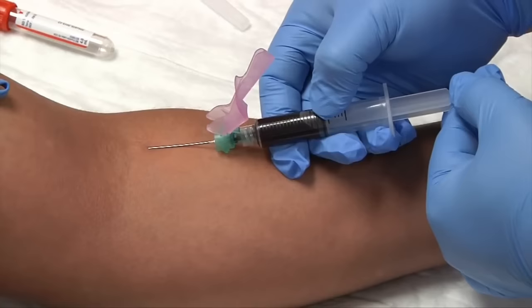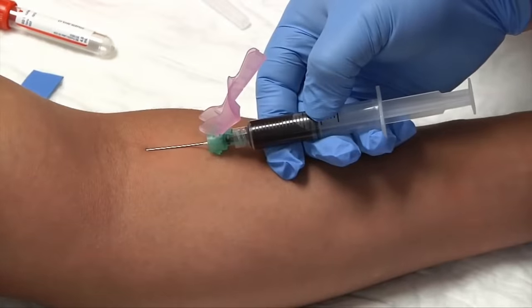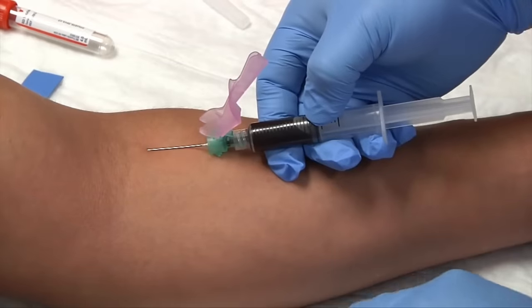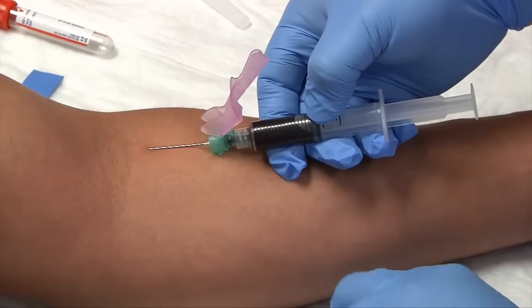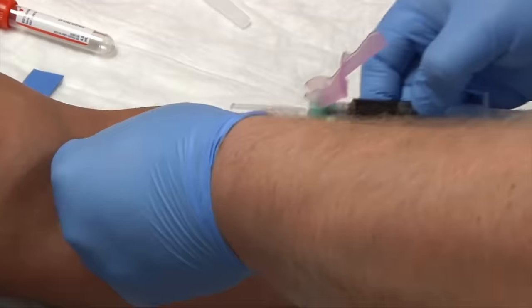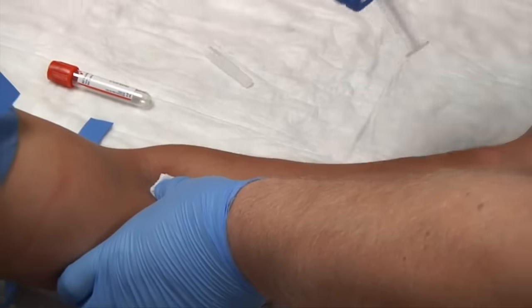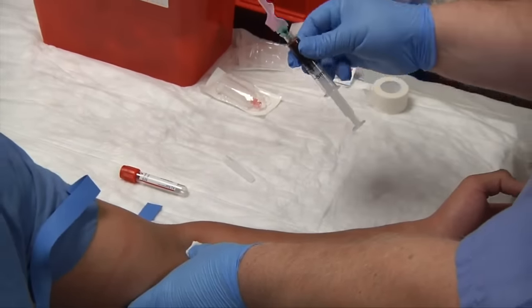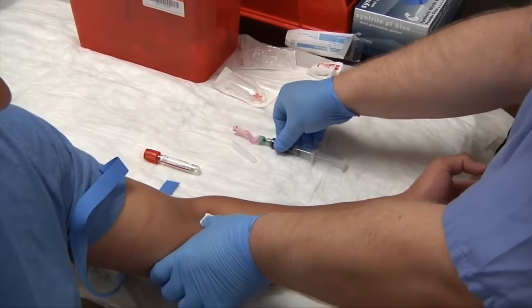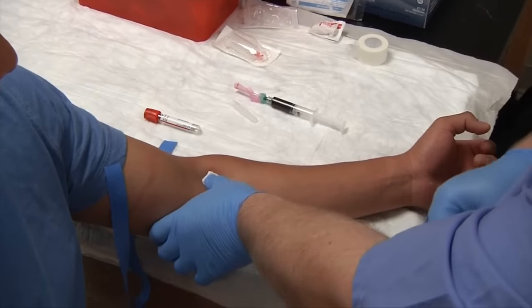It looks like I almost have my three milliliters of blood, so I'm going to release my tourniquet, grab my gauze, fold it over once, fold it over twice, pull the needle out, apply pressure, and immediately engage the safety cap. In this instance only, we can set the syringe down on our disposable chuck and finish bandaging our patient.